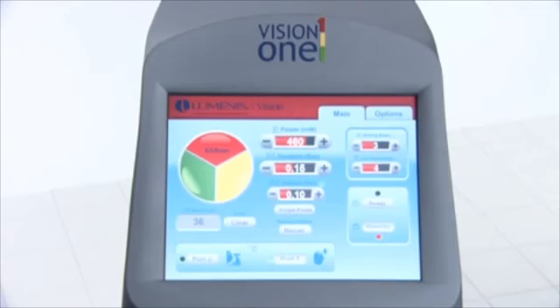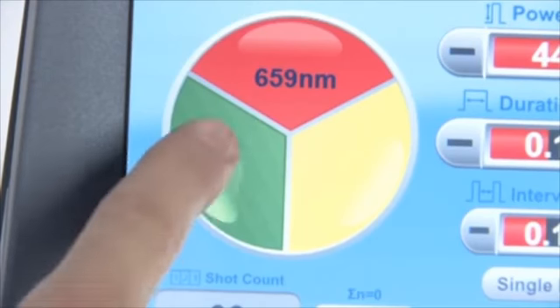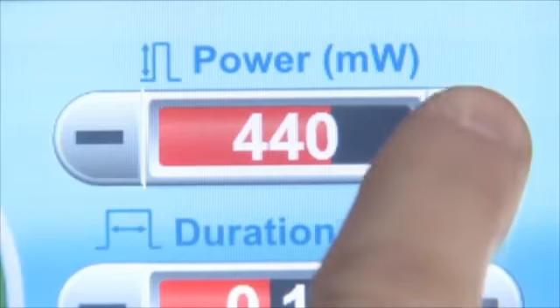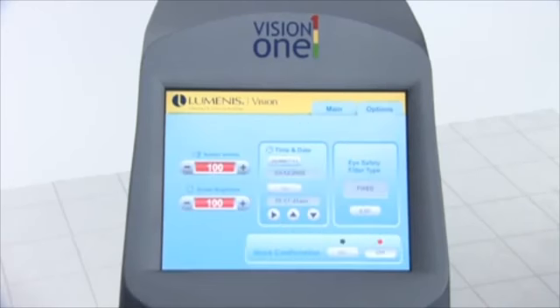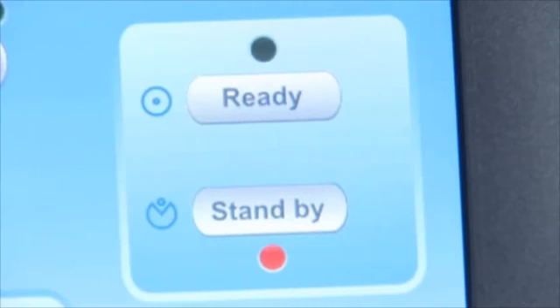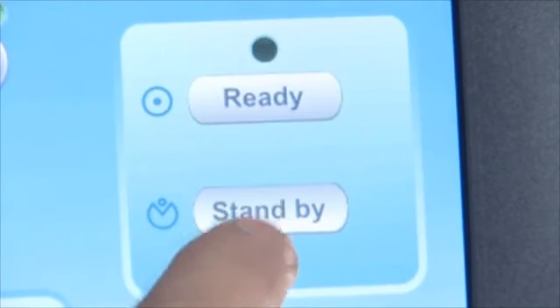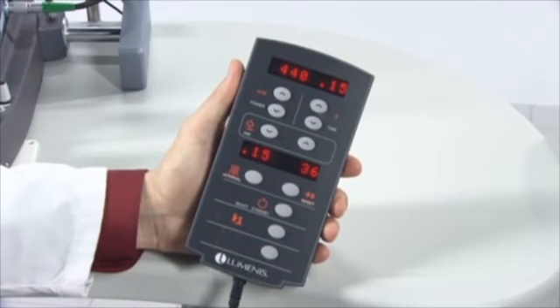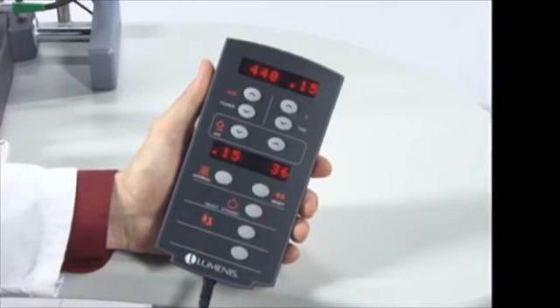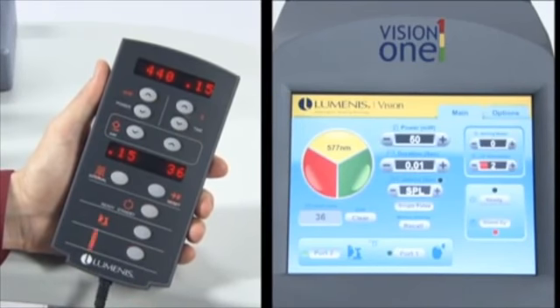The touch-activated control screen is displayed in both English and icon mode. From the control screen, you can view and select treatment parameters, such as laser color, power, and exposure time, as well as system options, such as volume and screen contrast. You can also select the laser mode, ready or standby, and view advisory messages. The remote control provides all of the necessary controls for setting treatment parameters. It can be used in place of or in addition to the laser control screen.